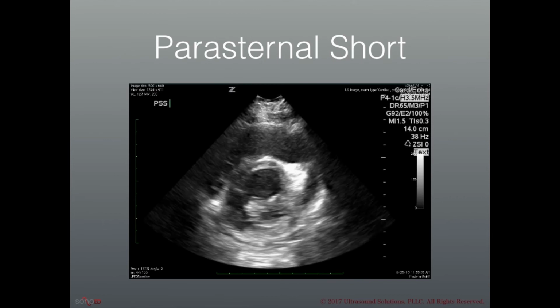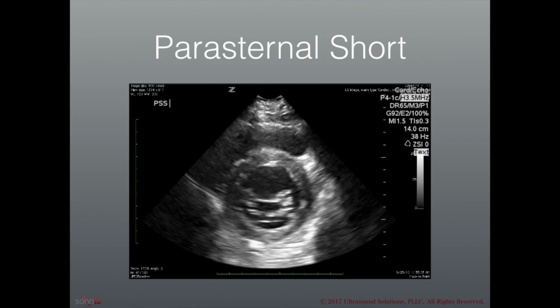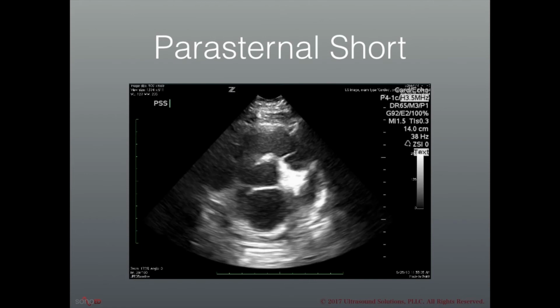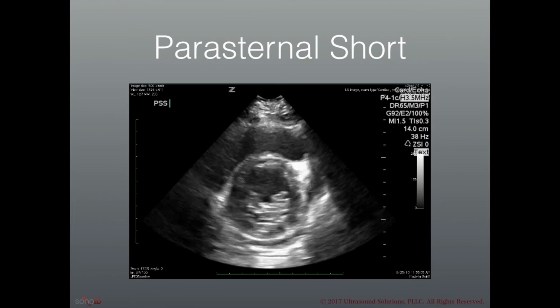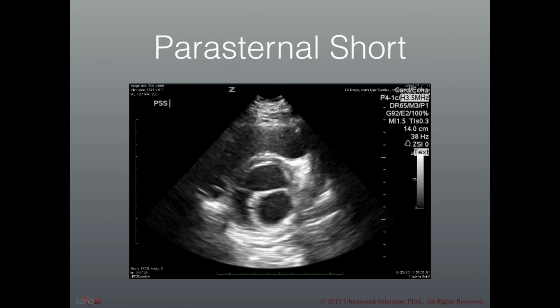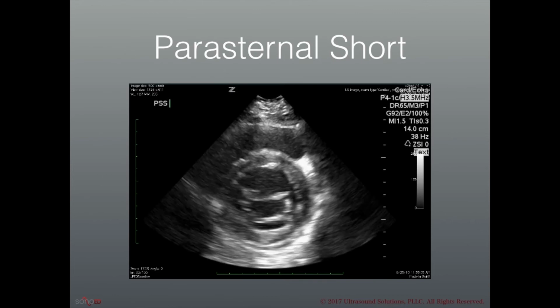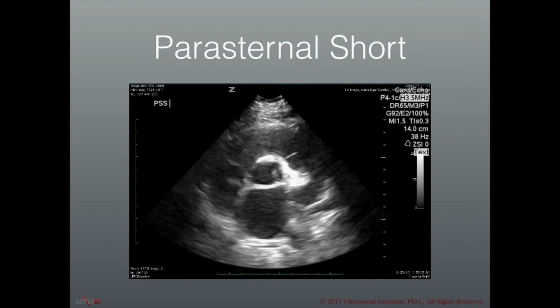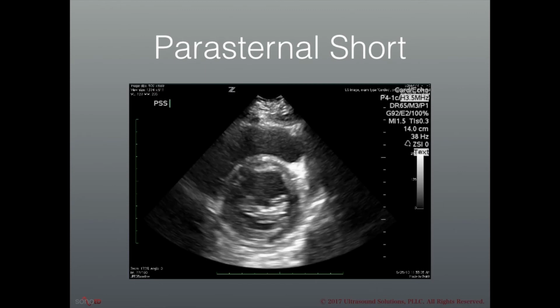This view never gets all the way down as far as we would like it. It actually stops at the level of the mitral valve, which kind of looks like a fish mouth opening and closing. The reason that that is also a less than ideal view is not only because we want to assess the left ventricular function inside the lumen of it, but because were you to have right heart strain, the mitral annulus, which is kind of the skeleton of the heart that surrounds the mitral valve, can prevent collapse of the left ventricular septum at that level, and you could miss it.